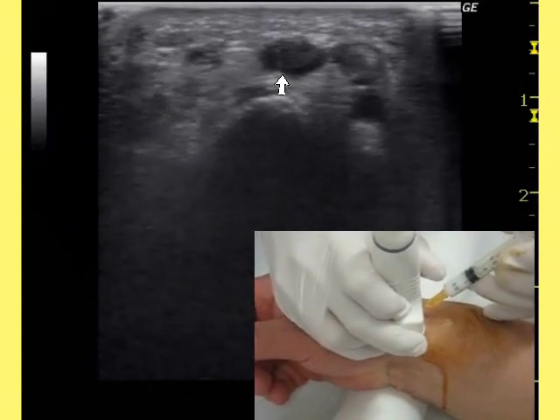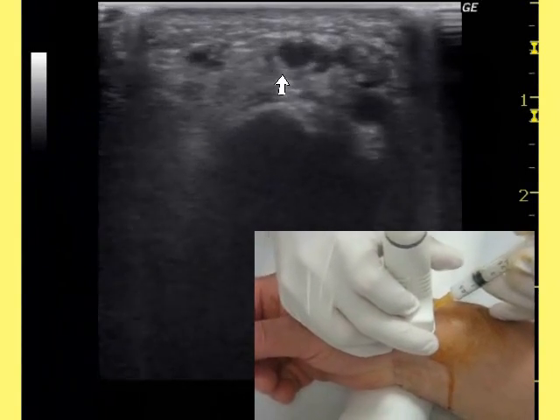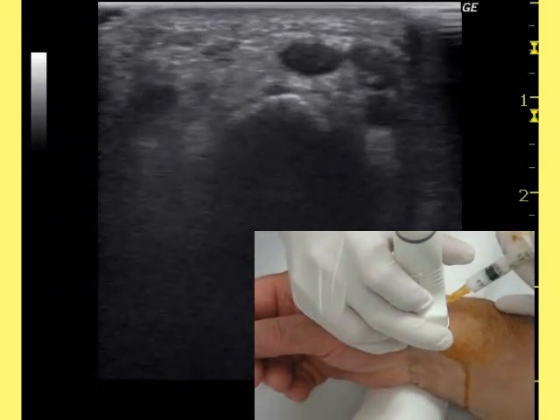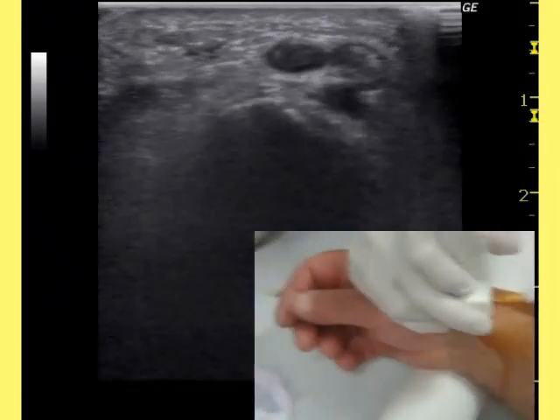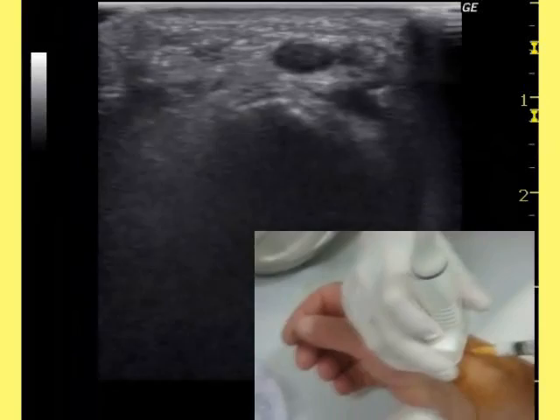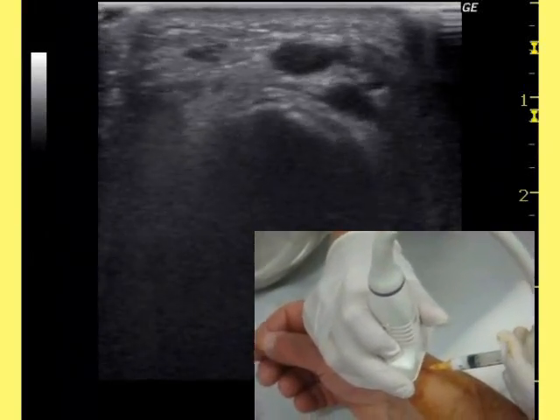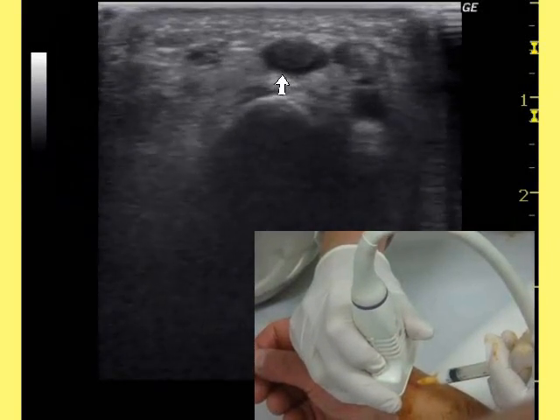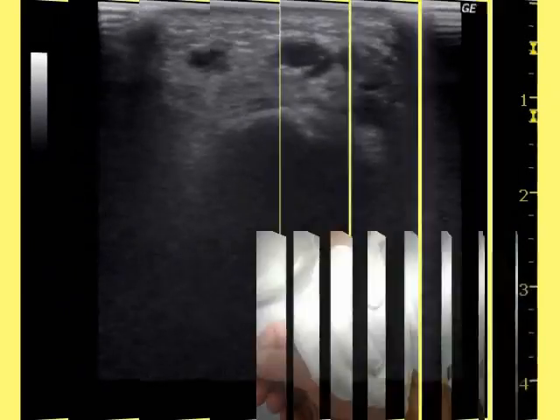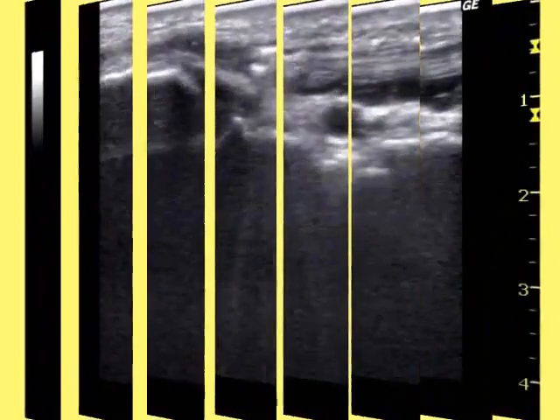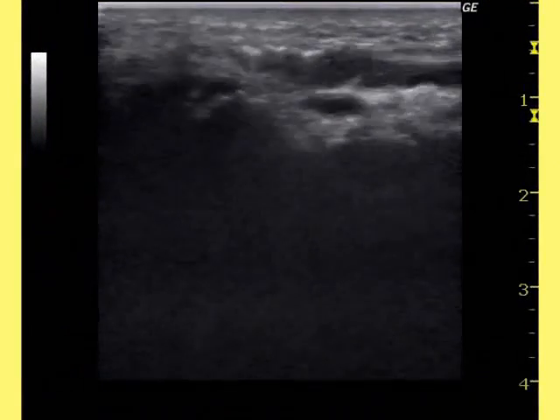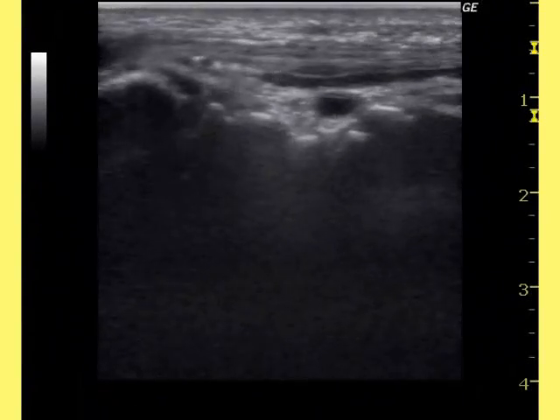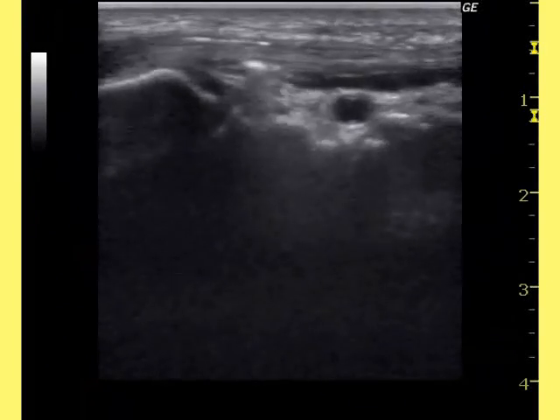Finally, the injection occurs. Here, we prefer to introduce the needle perpendicularly to the transducer. Ultrasonography shows the distribution of corticosteroid in the extensor retinaculum and the reduction of its thickening, which improves the movement of the tendons.